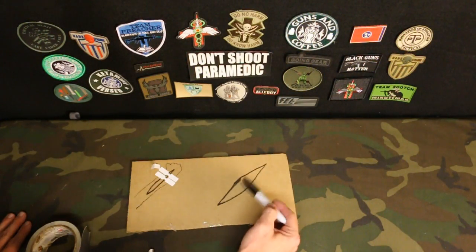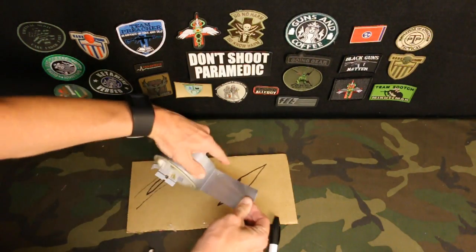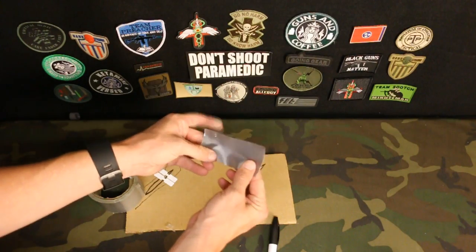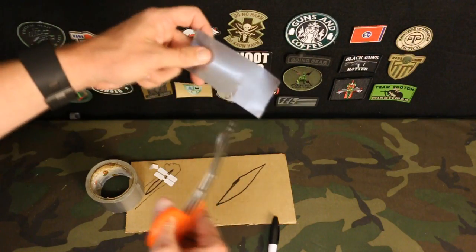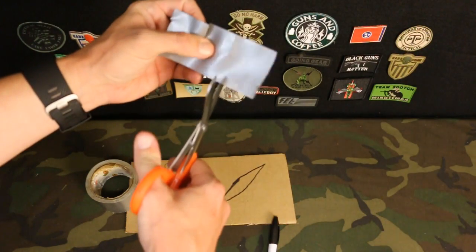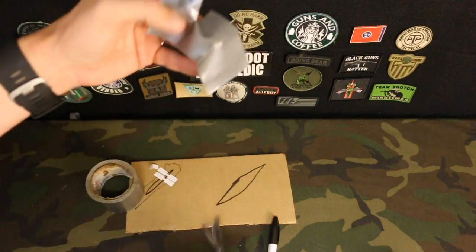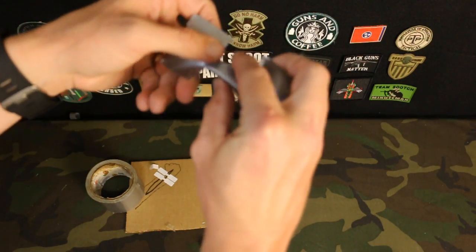Alright, so we have our cut here. This is where we're going to try to close up. This is a really big gash, by the way. So take your piece of tape, measure it the approximate length you want. Maybe go a little bit bigger than what you anticipate you may need. Alright, so now we have to make our center sections like we had in our butterflies. So we can cut here, turn the other side here. We don't want to cut all the way into it now. Cut here. So now fold this over, fold this over.